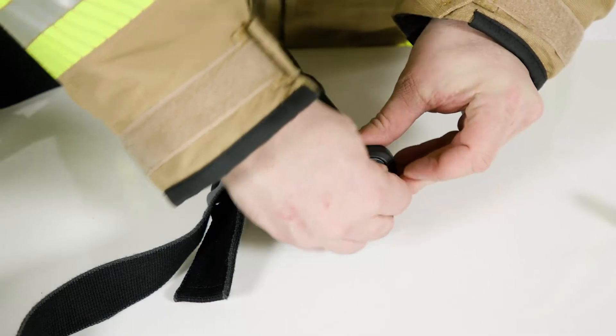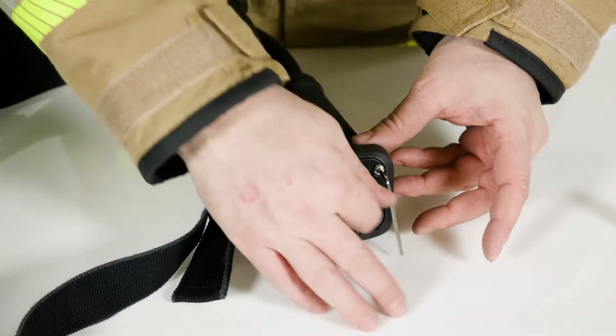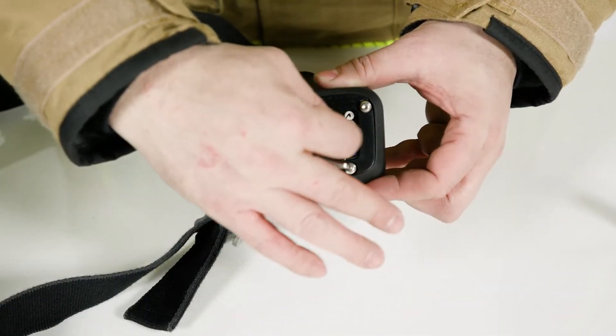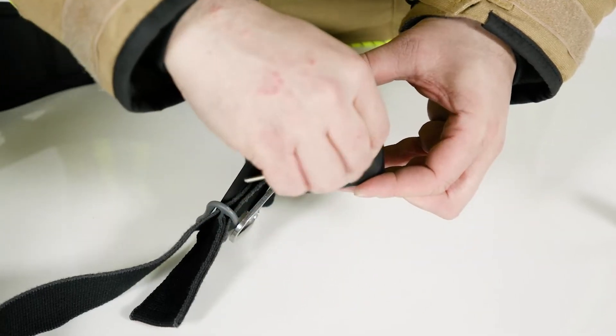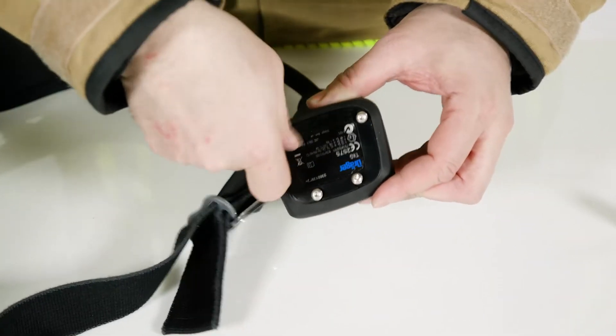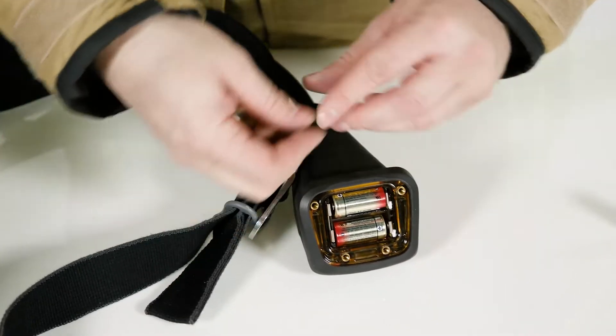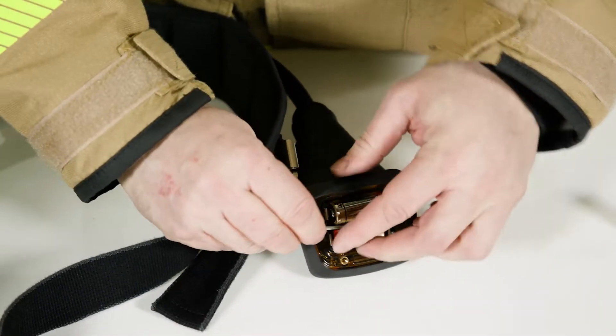The PSS AirBoss Agile has a battery life of 12 months, based on a usage of 30 minutes per day, 300 times per year. To replace the battery in the gauge, unscrew the four screws on the top. Take off the battery compartment lid. Replace the batteries.